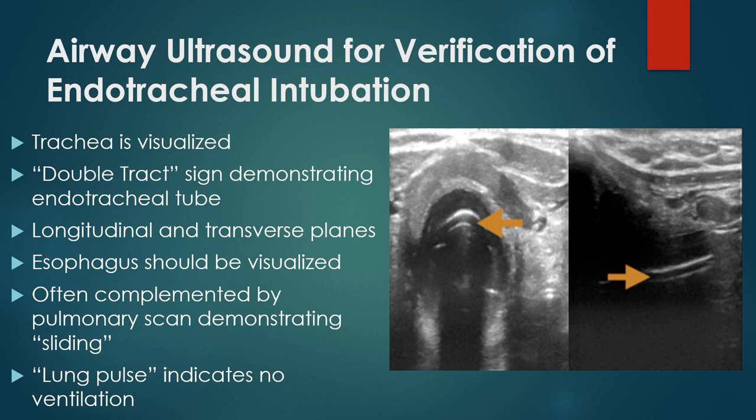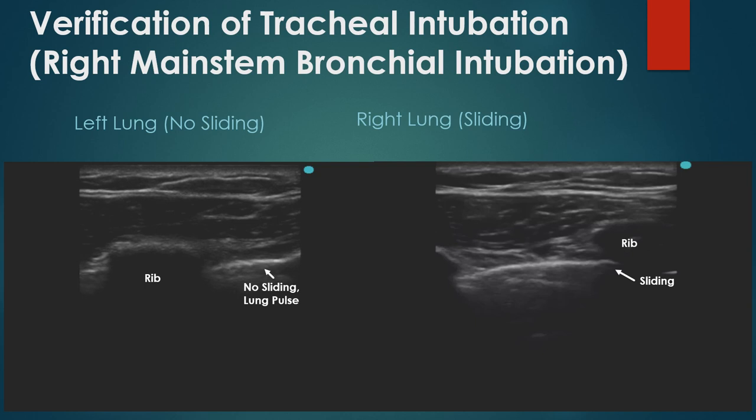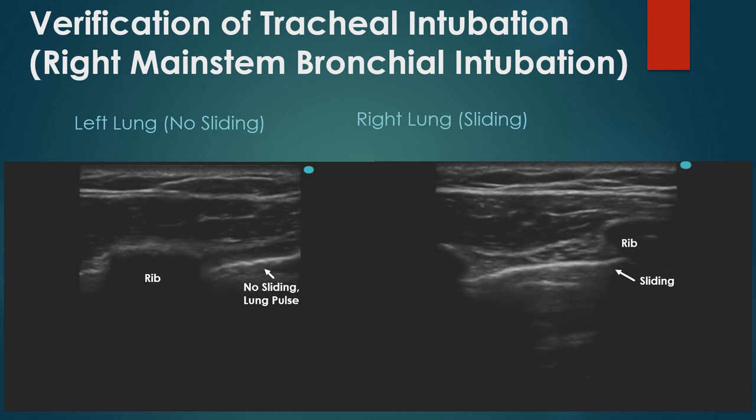And it's often complemented by a pulmonary scan demonstrating sliding. Some people like to use lung pulse, but sliding is so much quicker. And we'll talk about that and the utility of that in just a moment. And the moment has passed. We're going to verify tracheal intubation, which you may or may not have heard about.